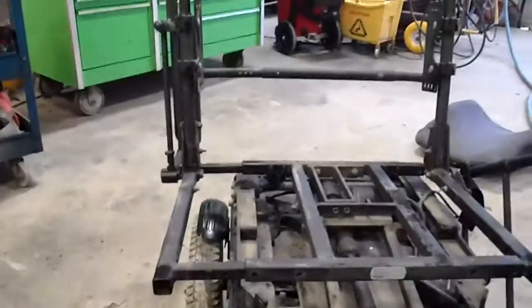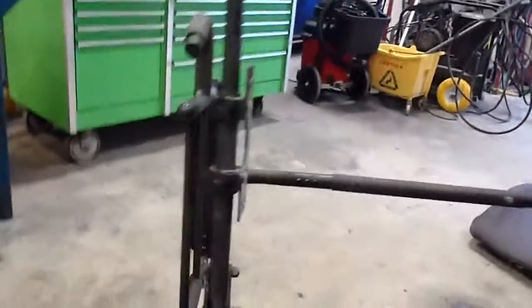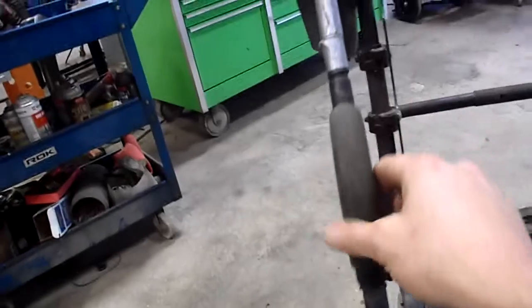Great, now it's not going to come off. Right out. They were pretty seized up, so I've been using some penetrating oil. See? So you could potentially make this thing really wide, and that's what I'm going to do. I'm probably going to swing these right out so that I can still keep these. Oh, no. Is that locked? Oh, no. I'm pulling on the wrong part. There we go. So I can keep these hand rests.